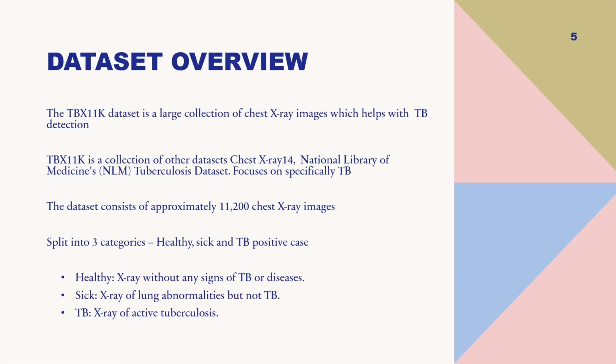So the dataset that I chose to use for this project is the TBX11K dataset. It is a large collection of chest X-ray images specifically focused on TB detection. TBX11K is a compilation of other datasets like ChestX-ray14 and the National Library of Medicine's tuberculosis dataset, which makes it a robust resource for training the model.